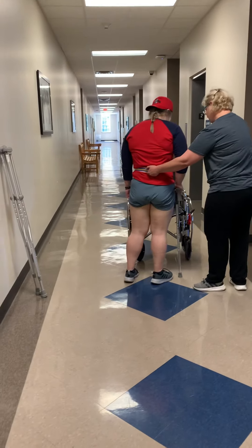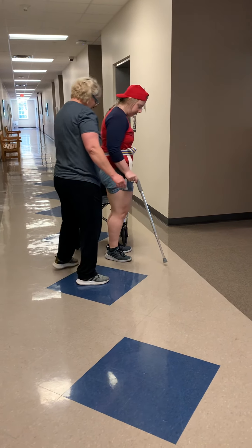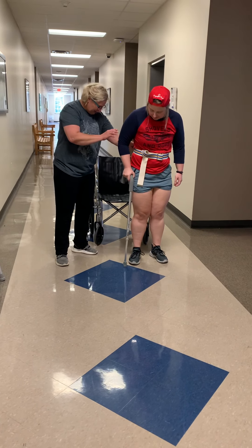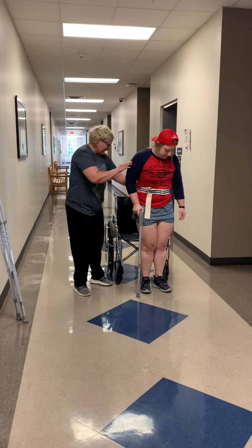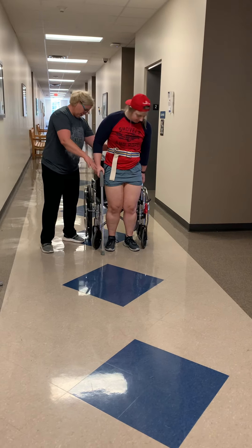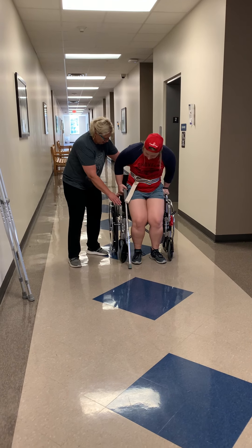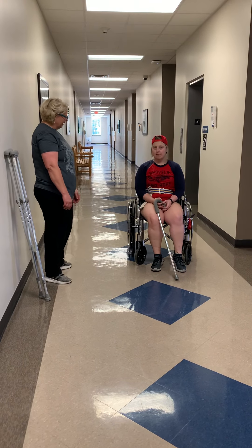All right, let's do a little turn here — we're going to turn towards your right again. I'm going to have you back up here with your cane. There you go. Go ahead and step with your left and your right. Keep backing up just a little bit more so you can feel that against the back of your legs. And then go ahead — there we go, perfect. And just slowly lean on back. Perfect. How'd that do? Feel good? Yep. All right. Well, thank you.